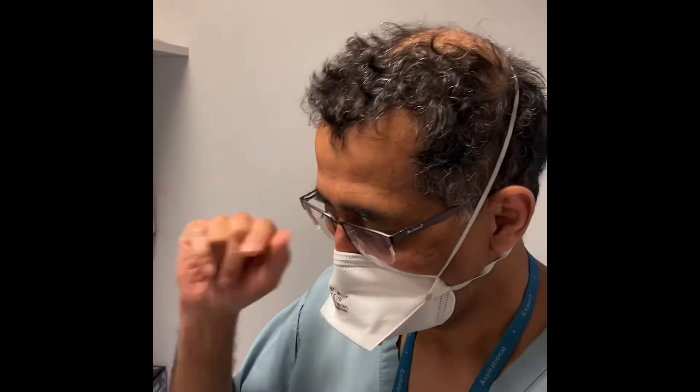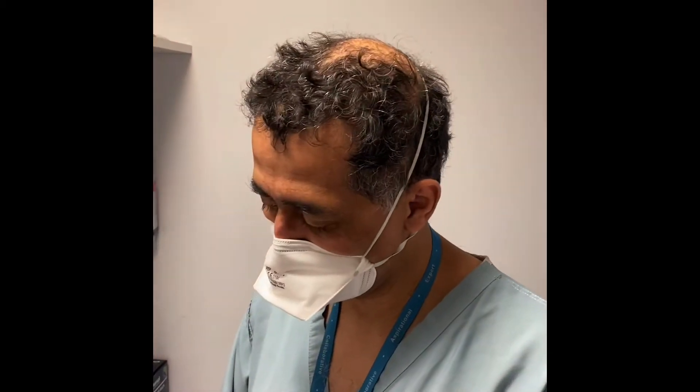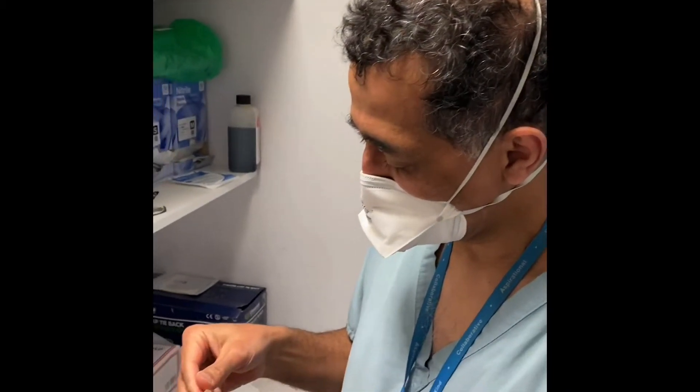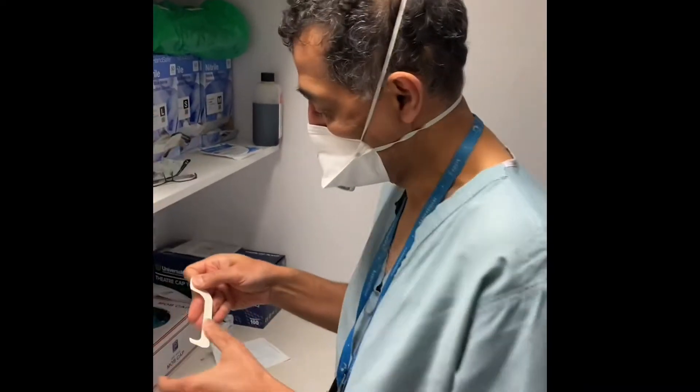We need a mirror because otherwise you can't see what you're doing. I'm going to take my glasses off. I've cut a Tegaderm into pieces — each Tegaderm is cut into three — and then I'm going to take each one and peel it off. If your skin is very sensitive, this is not going to be good, because mine is already peeling a bit.